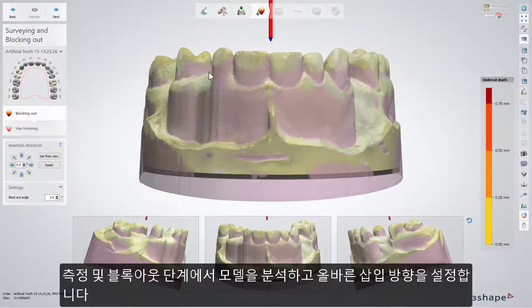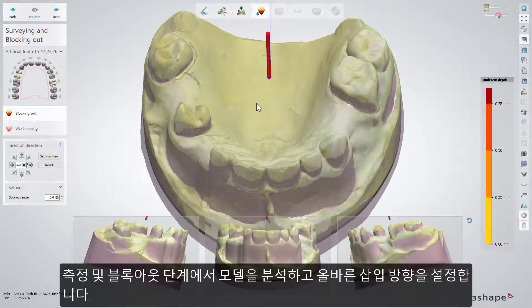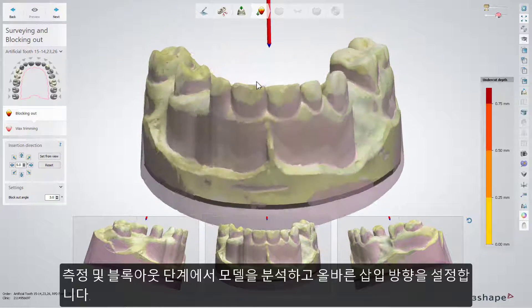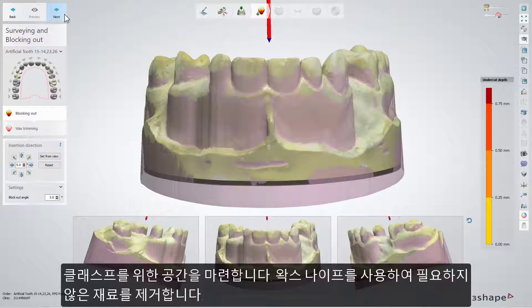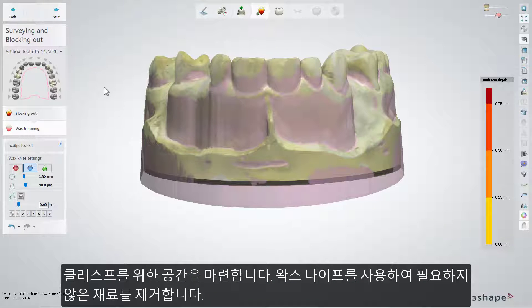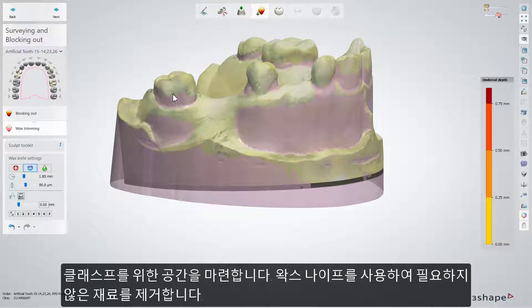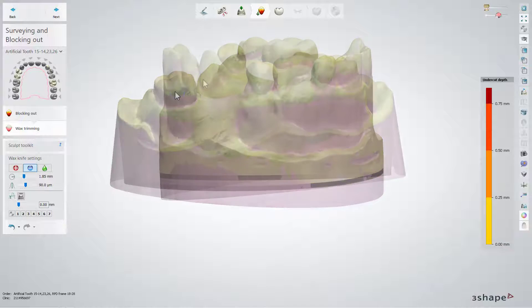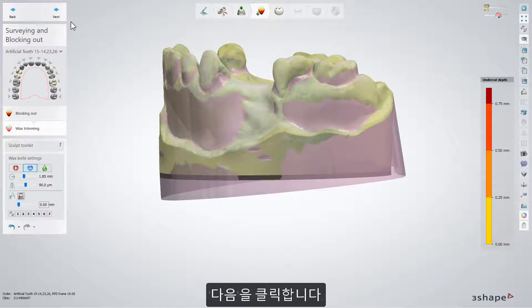In the surveying and blocking out step, analyze the model and set the correct insertion direction. Prepare the space for the clasps. Use the wax knife and remove unnecessary material. Click next.